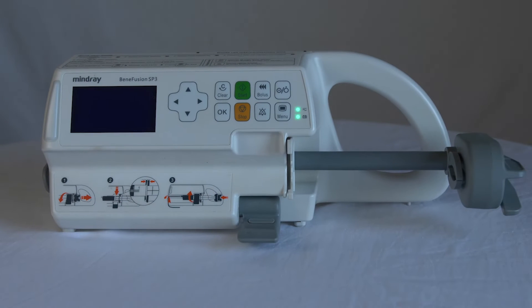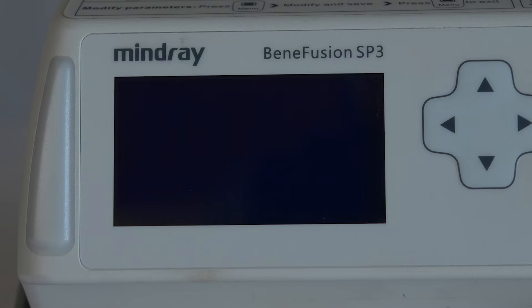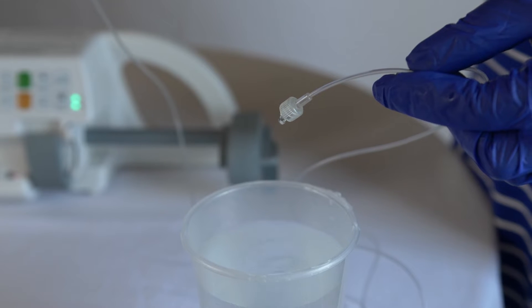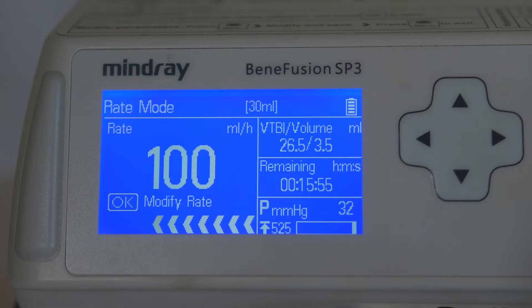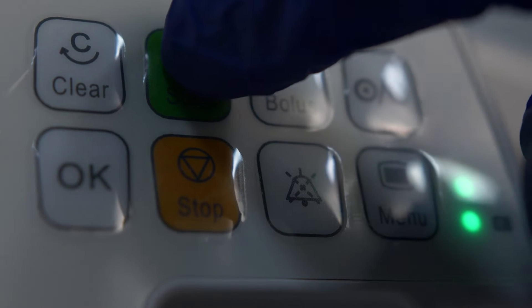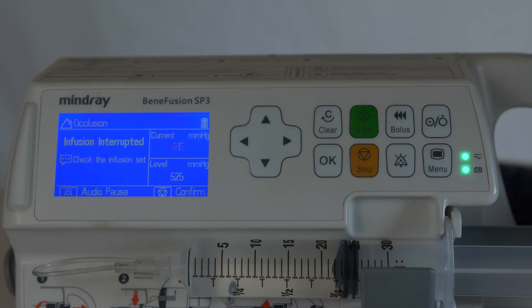In this video, we will demonstrate how to use the Mean Ray Benefusion syringe pump. Syringe pumps can be used to gradually administer fluid to a patient. We will demonstrate how to begin an infusion and respond to an occlusion alarm.